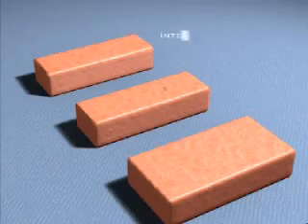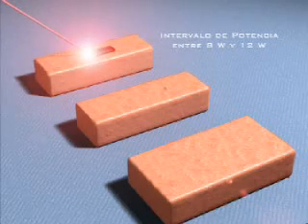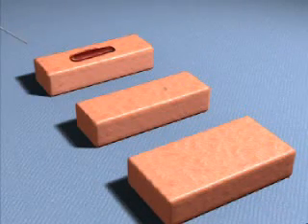The key to this technique consists in firing the laser pulse only after confirming the position of the laser fiber by transillumination through the bone with the nasal endoscope, thereby avoiding false pathways and iatrogenic lesions. A power setting of 8 to 12 watts will give fast, deep incisions.